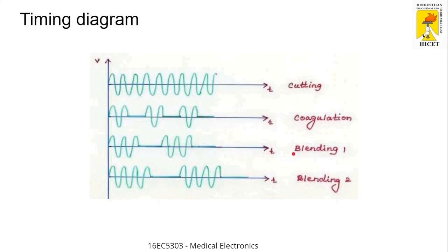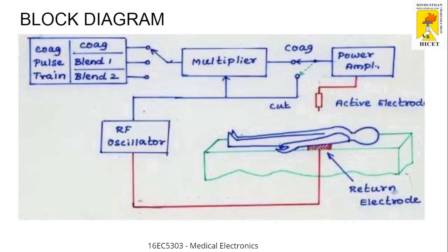But before that, I forgot to say, I mentioned one particular key point, that is coagulation. I gave you an idea, and I think you may be able to understand what coagulation is, but how it takes place is very important. If you place the electrode away from the skin surface, due to heat, the liquid particles available in the tissue will be evaporated, and that way the tissues will become closer to each other and automatically get bound to each other.